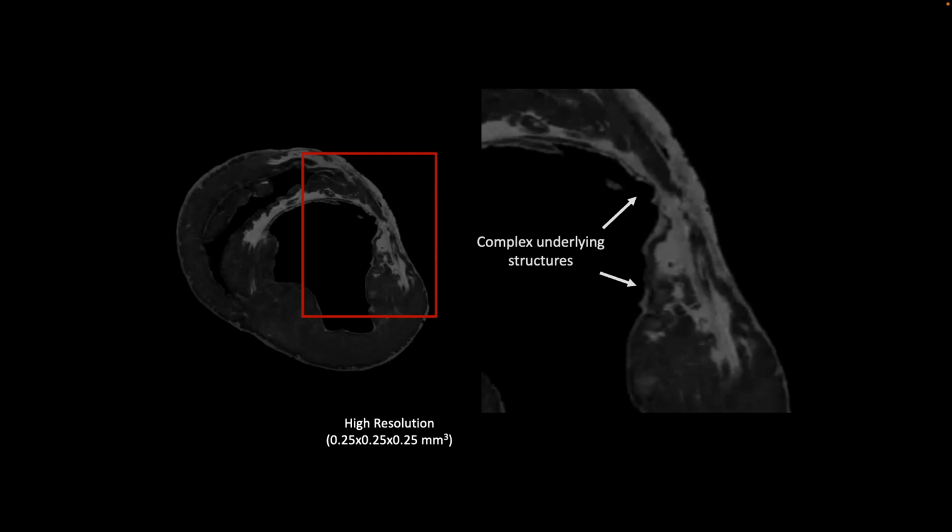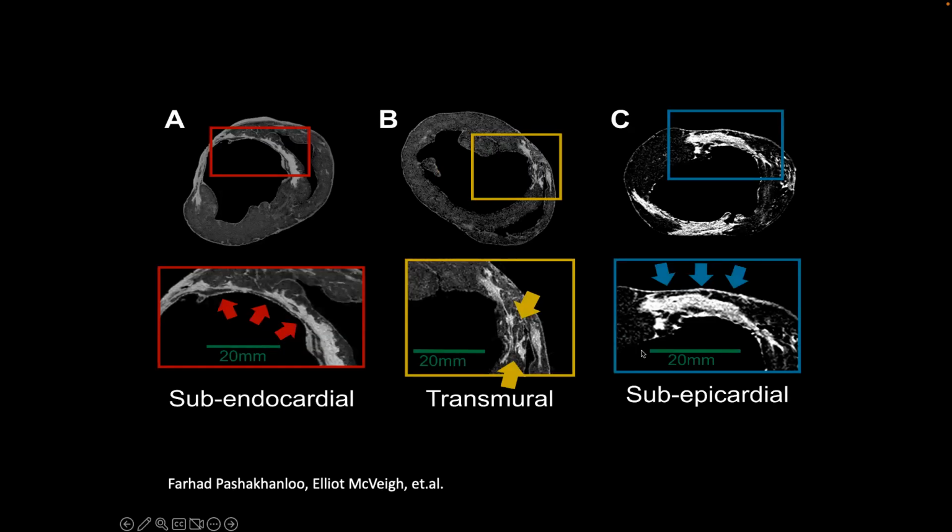And so what we did with this was we imaged a lot of these infarcts, and then we quantified tissue with its channelness. Like, what are the channels of normal tissue that are running through this? Is there a way mathematically to say, you know what, this tissue has a really high channel number, and therefore it's going to be risky for generating arrhythmias? And you can do that.